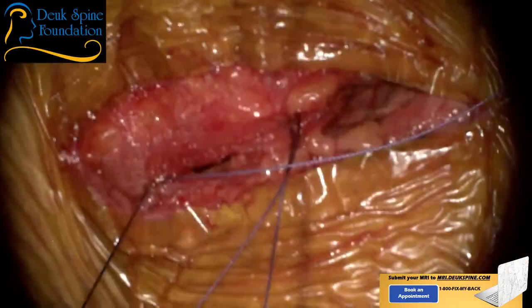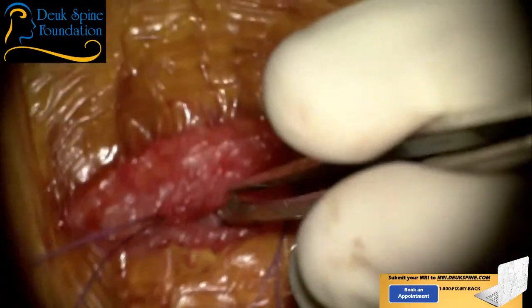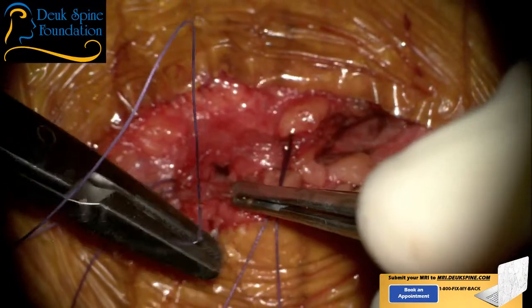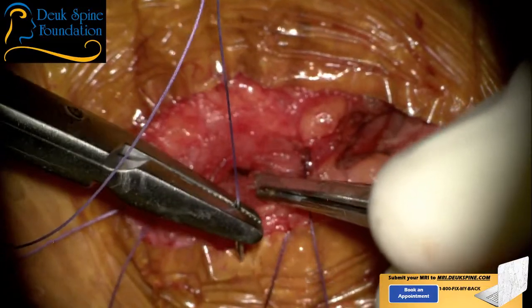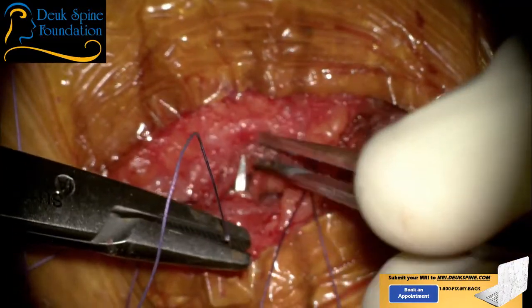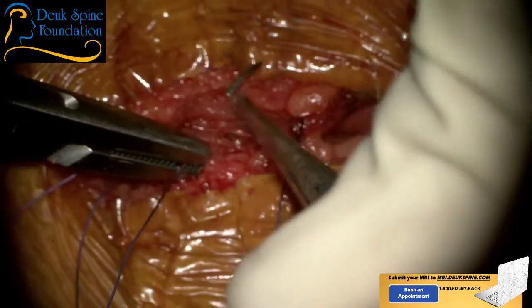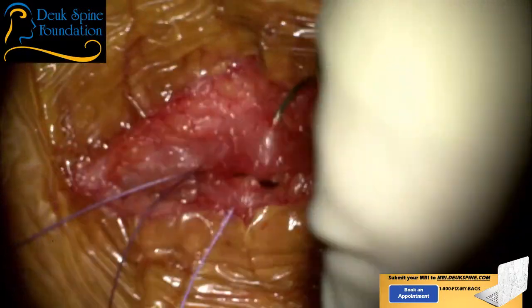So the platysma muscle is the first layer you're going to close. You don't close anything deeper to that. Careful. Don't get the fat. You don't want the fat, because then you won't be able to do the sub-Q. Yep. There you go. Nice technique. I like that. You kind of grab the muscle and bring it to the needle, right? Very good. That's a smart technique.